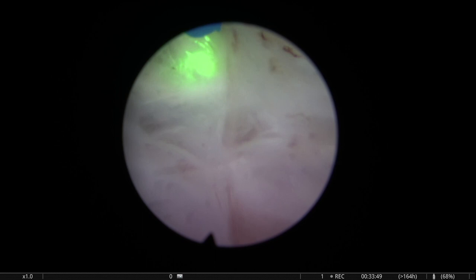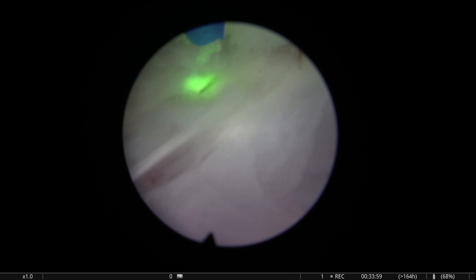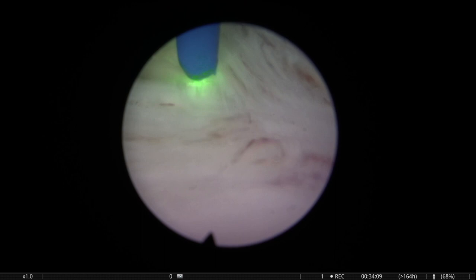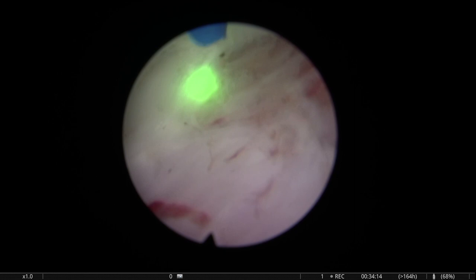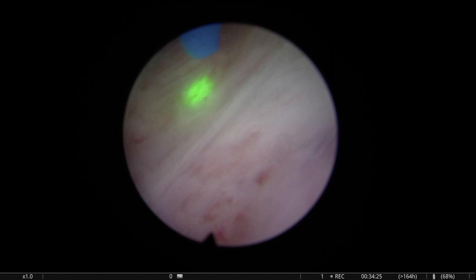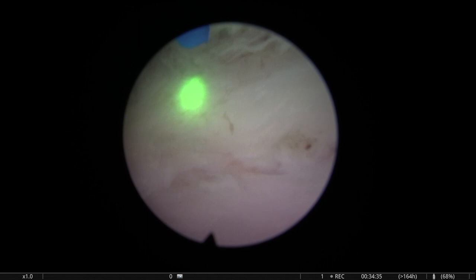Sometimes, of course, you're building up your experience, you have to face a larger gland and you cannot get anxious, you cannot panic. You have to be quite relaxed and just move forward. It'll take longer or not, you shouldn't put this pressure on yourself, and this way you will get to do the large glands as well. Of course, in this operation, if you stick to the principles, progressing in the interface, not going excessively deep, removing the adenoma, keeping good hemostasis, etc., then you're going to be able to do this operation successfully.